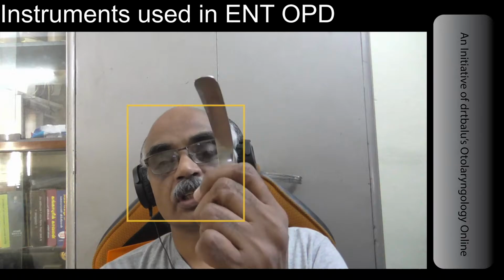This tongue depressor is used to slowly depress the tongue to examine the oral cavity and the throat. It is ideally held in the non-dominant hand so that the dominant hand will be free to do the manipulations or instrumentation which may be needed. You hold the tongue depressor like this and then gently depress the tongue. You should not ask the patient to protrude the tongue. You just ask the patient to relax the tongue.